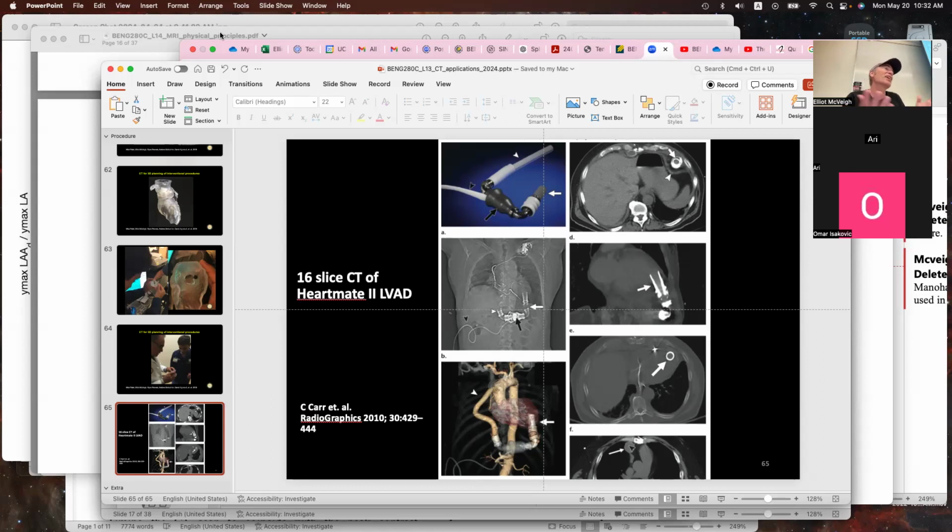And that's possible to do. Or you've deployed a stent in a coronary vessel and you didn't go far enough. For whatever reason, the stent ends, but there's still more vessel behind it that has a lesion on it. You just put another stent inside that first one, and then you continue to open it up. So you can gang them together and things like that.